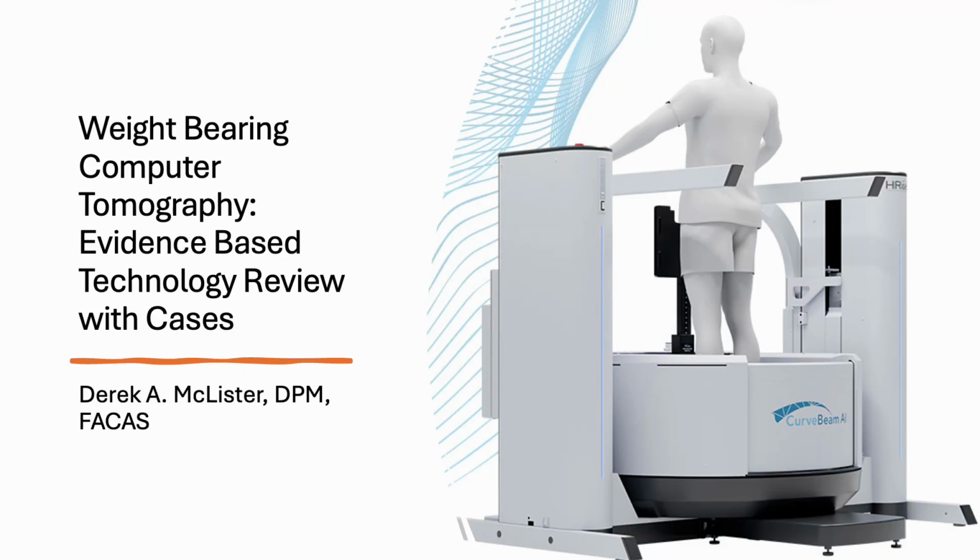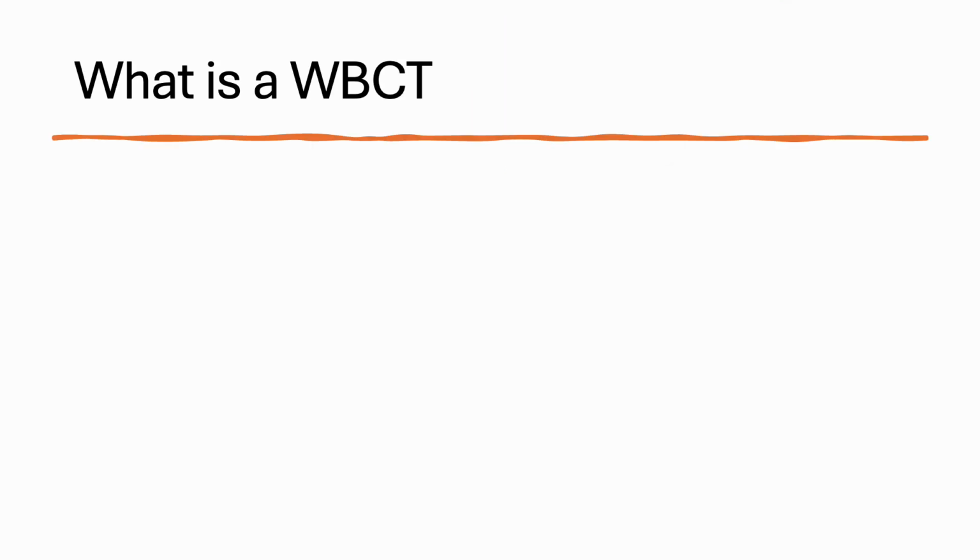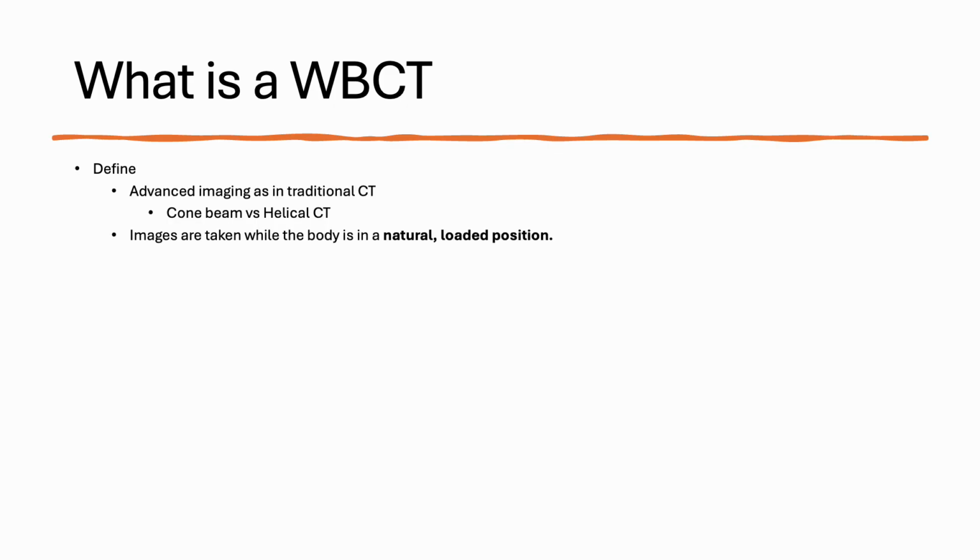We're going to be talking about weight-bearing CT scans using evidence-based medicine through the technology, and I'll have some cases to review throughout the presentation. So, what is a weight-bearing CT scan? It sounds exactly like what it is.